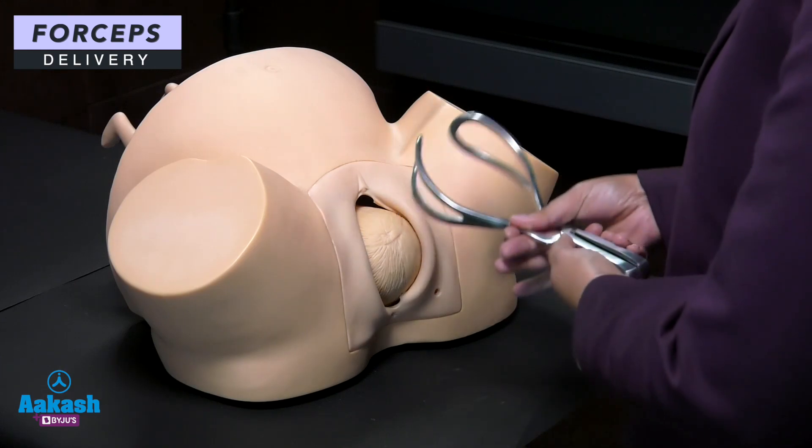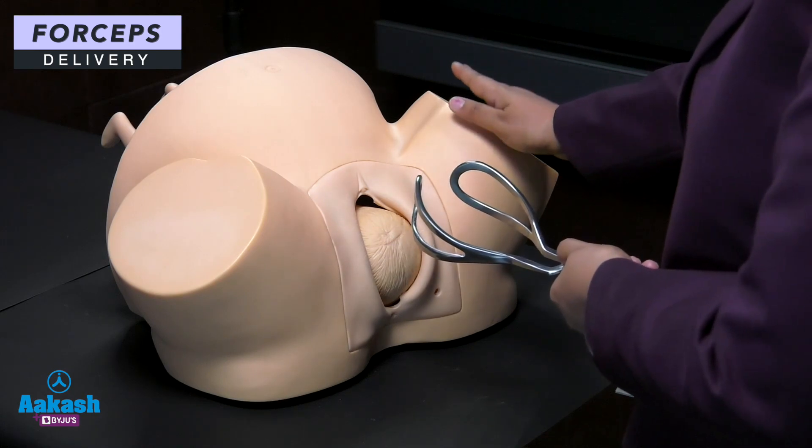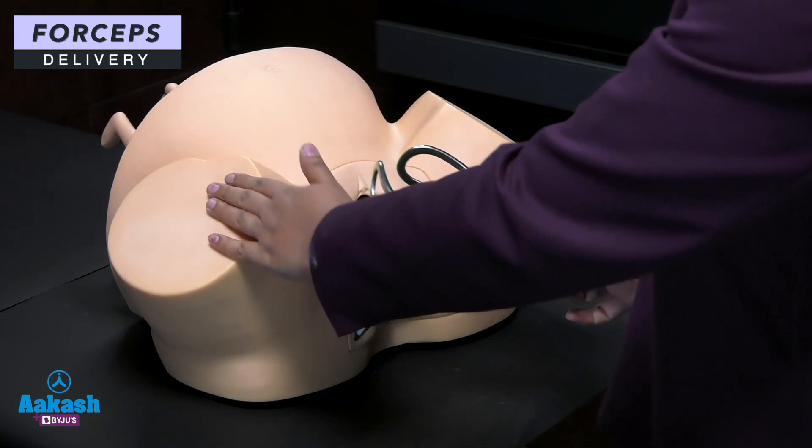To identify the blades, hold the forcep in front of the mother. The blade which is facing the maternal left thigh is the left blade, and the blade facing the maternal right thigh is the right blade.